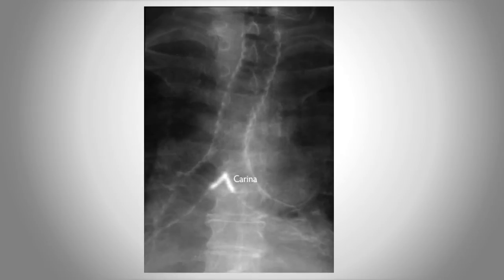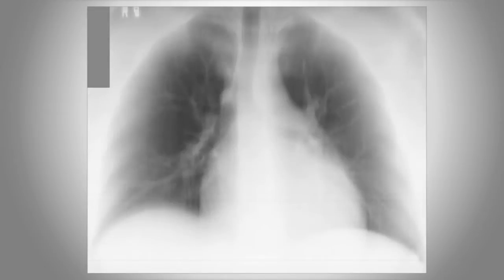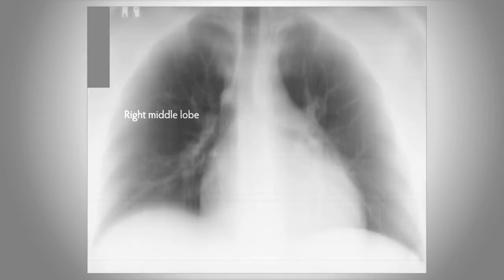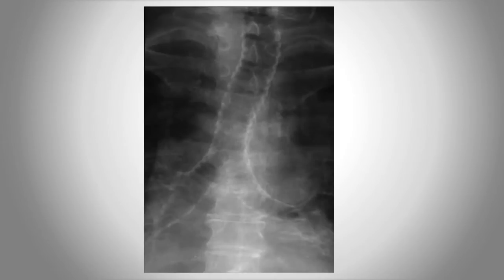The carina, which comes from the Latin word meaning the keel of a ship, is at the bifurcation of the trachea into the left and right main stem bronchi. The right bronchus leads down to the bronchus intermedius, which then branches to supply the right middle lobe and the right lower lobe. When looking at the carina straight on, it appears slightly to the left of the midline, which lines the right bronchus up as a direct continuation of the trachea.